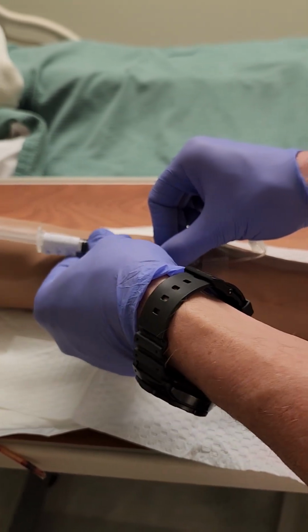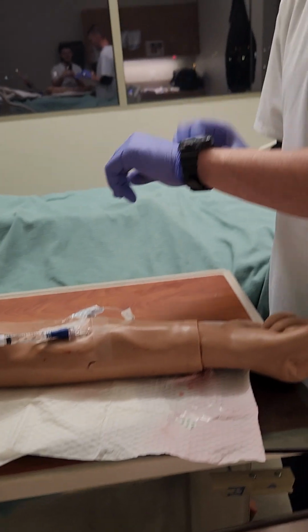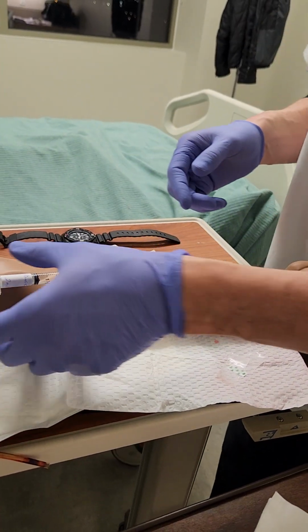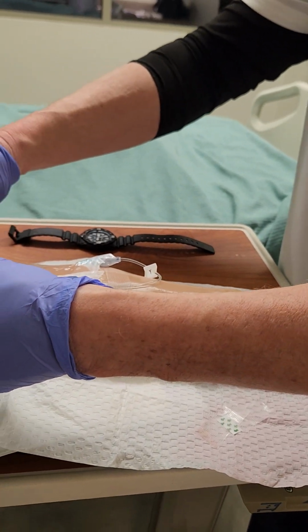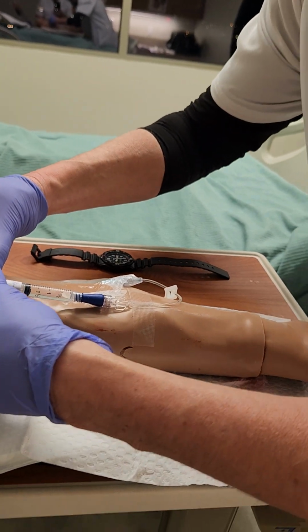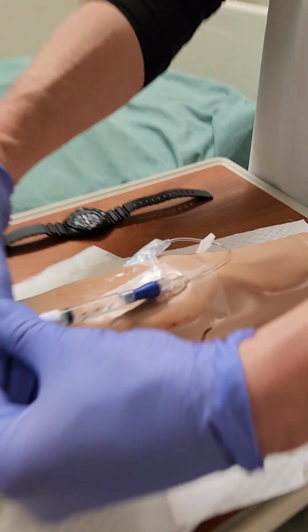So what I'm going to do is I would use my cell phone, which is in my observer's hand. But now I'm just going to set a timer. All right, cool. And I'm beginning my push. All right, let me know if you feel any differently. All right, your pain may be going away, or if not yet, shortly.